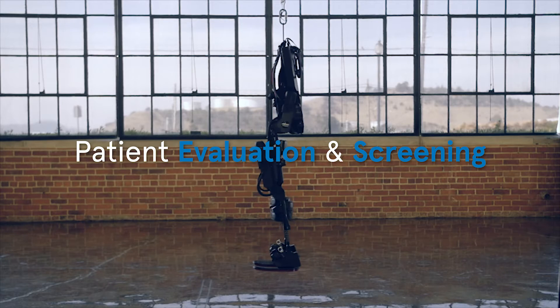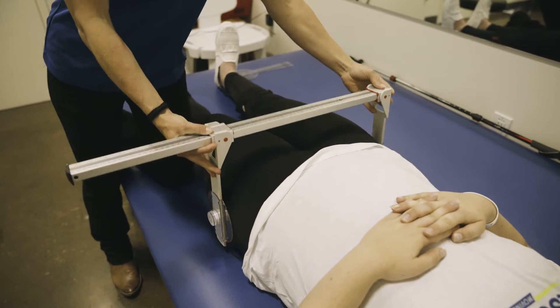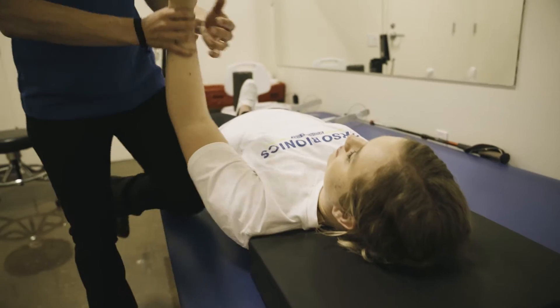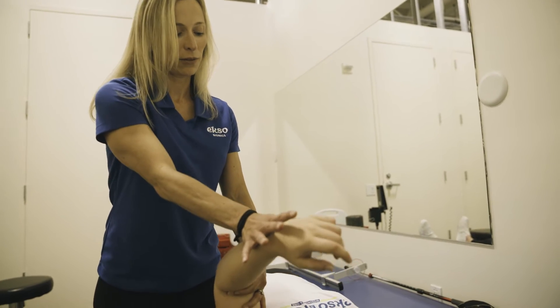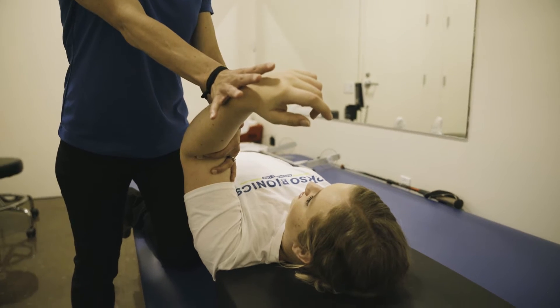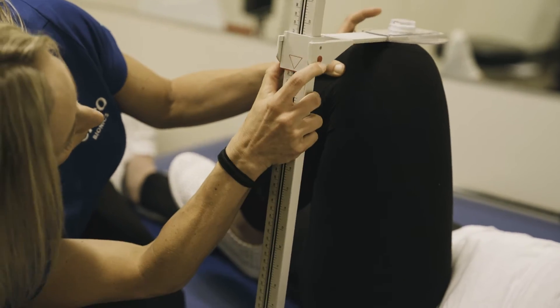Patient evaluation and screening: Every patient must be evaluated before using EXO-GT to determine that they fit the range of motion and strength requirements, and to determine how to program EXO to accommodate that individual. Before a patient may try EXO, their physician must sign a medical release.